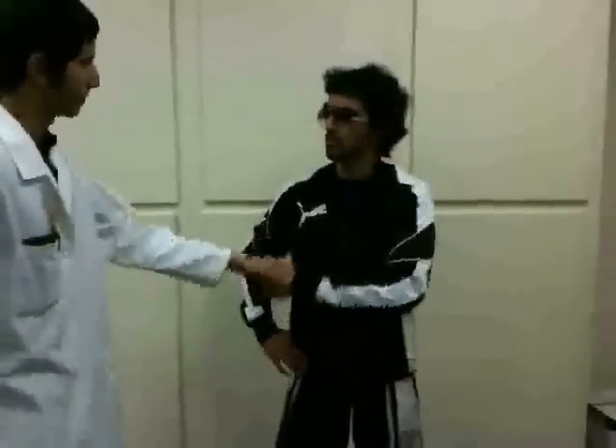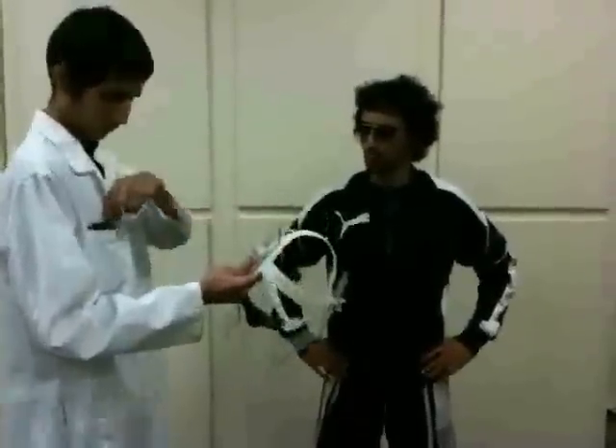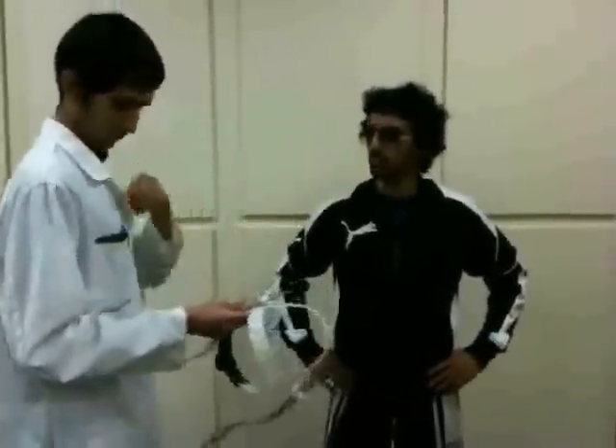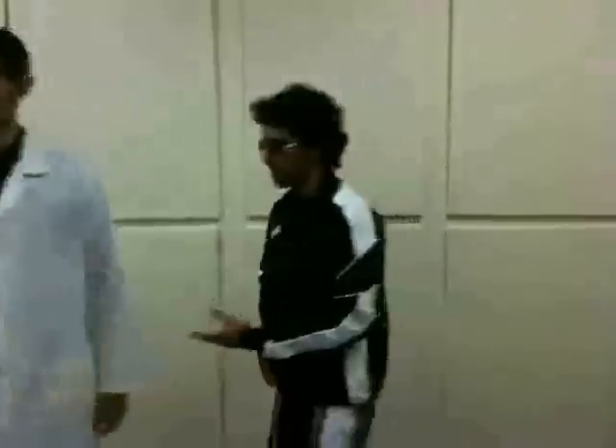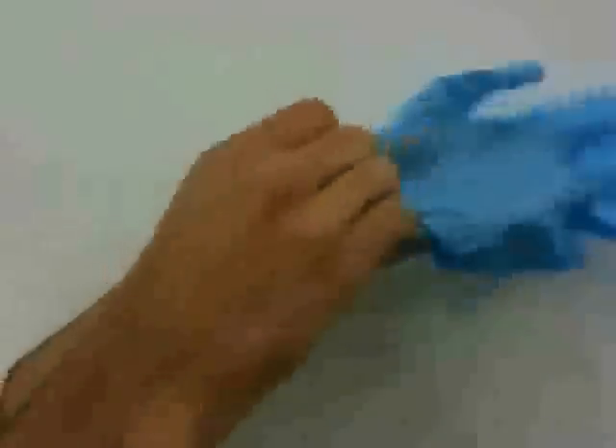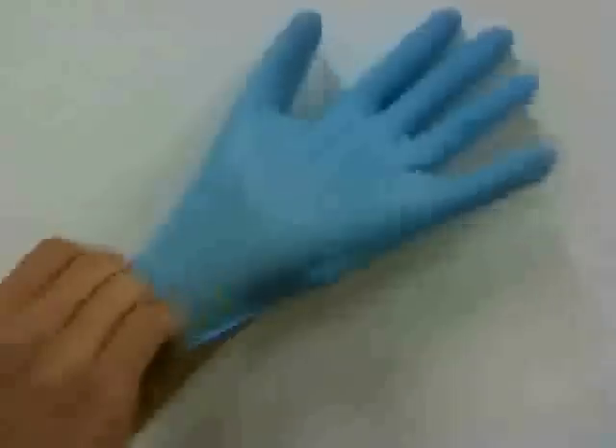Demonstration 2: Placement of the headpiece. It is important that the subject understand what he is about to go through for the testing procedure. The headpiece and the mouthpiece are quite uncomfortable, especially under strenuous exercise. Make sure you give him a friendly hello and show him the proper positioning of the headpiece on his body. And don't forget when working with a person to put on your gloves.